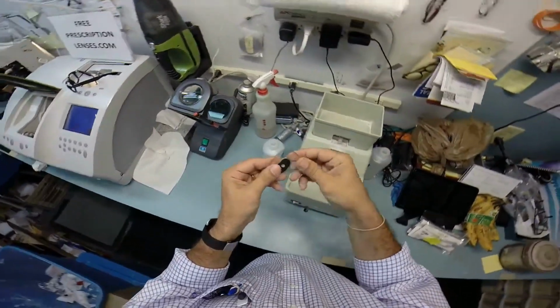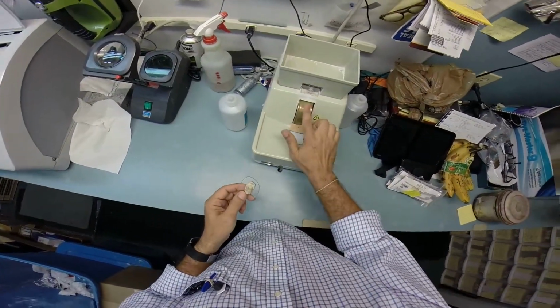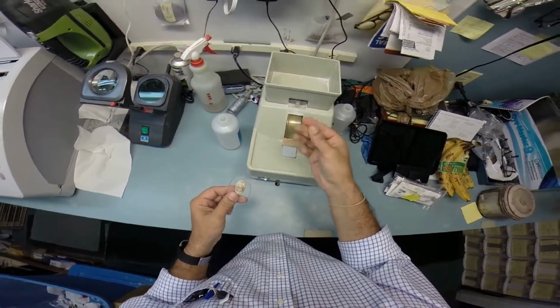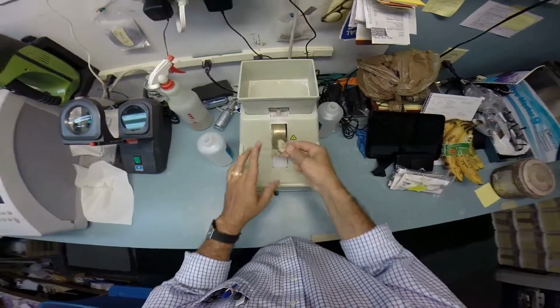So, you still have some rough edges left over from the cutting cycle, so I'm going to use my hand stone, which is completely flat. I can put my finger on it. My finger gets warm due to the friction, but it's that friction that allows me to apply what's known as the safety bevel.